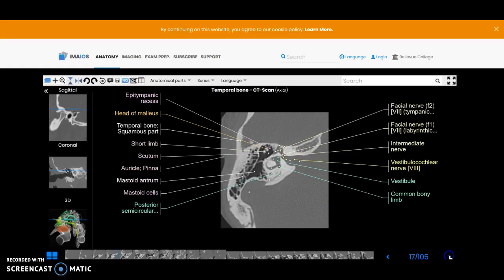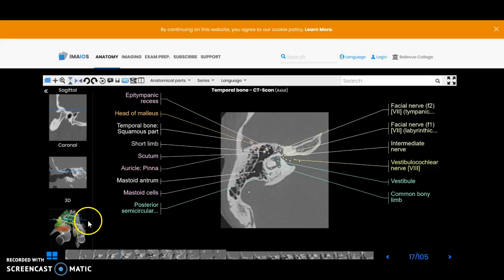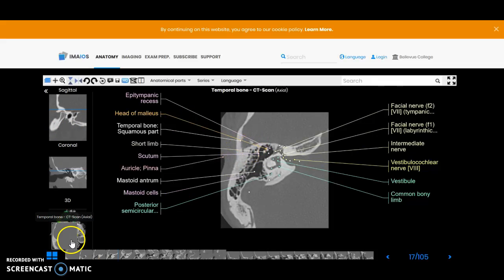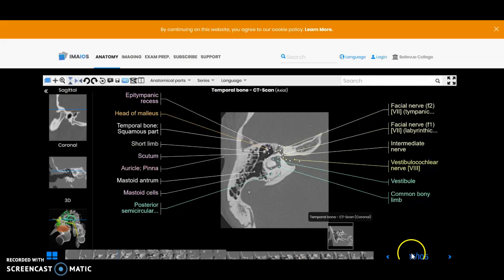We'll keep coursing inferiorly. Make sure to take a look at the 3D version as well as the sagittal version to see where we are. We're not quite at the TMJ joint here. We'll start to see that laterally and then we're going to catch the tip of the cochlea in another slice or two.